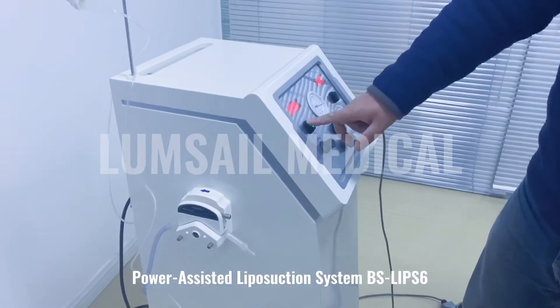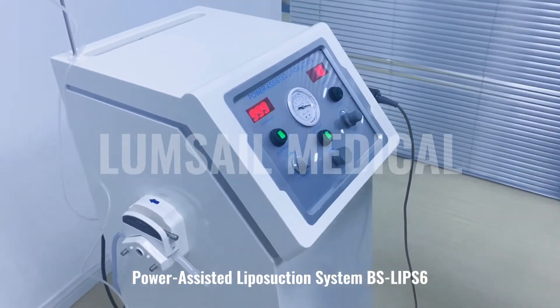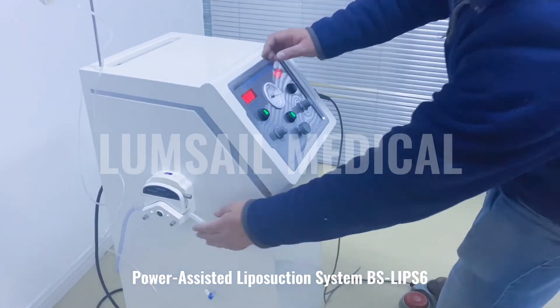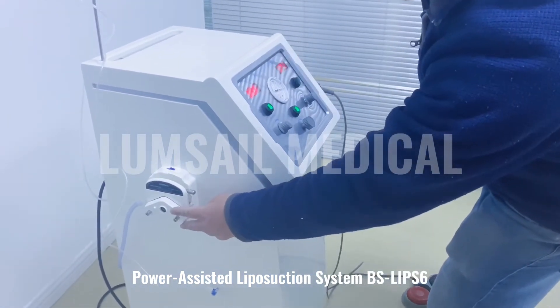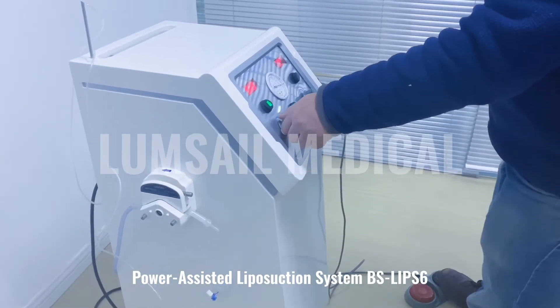We will demo how to use it. The power switch is already turned on. We use the foot pedal to turn on this function. You can see it starts to work. We can also use the knob to adjust the infiltration speed.